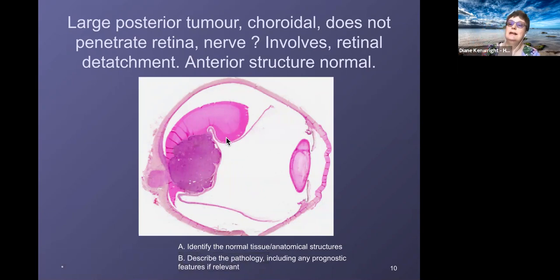The only way you can tell the etiology of a retinal detachment is by looking for the associated pathology. So for example, if this was a diabetic eye, we would see the fibrovascular membrane across the anterior part of the retina, and we would see neovascularization. So we would probably be able to work out that this was a tractional retinal detachment. And if we see a tumor and a big exudative retinal detachment, we will know that there are leaky vessels in this tumor causing it. So it's about finding the associated pathology rather than anything to do with the exudate that helps us tell the difference.